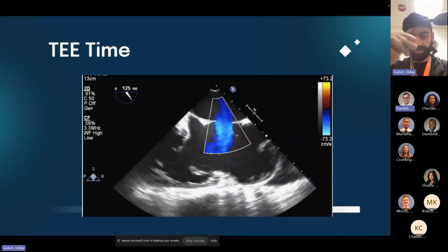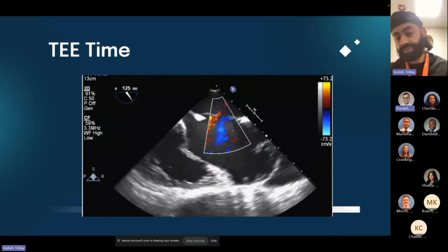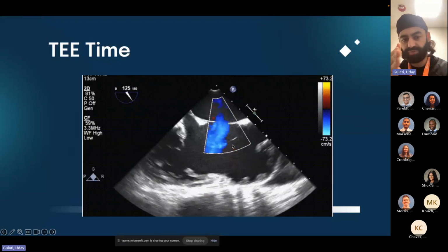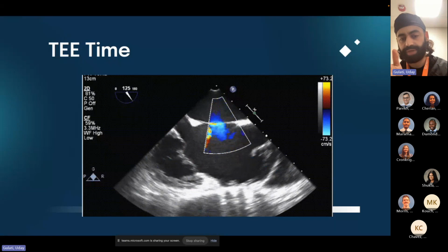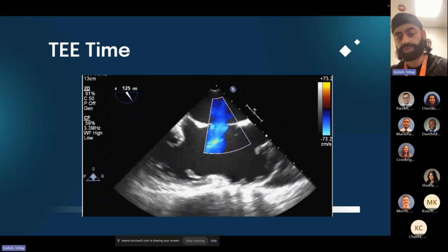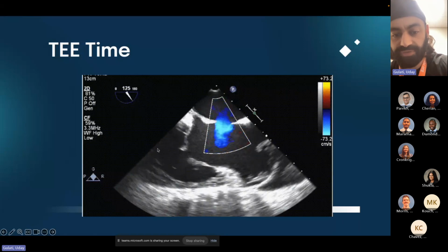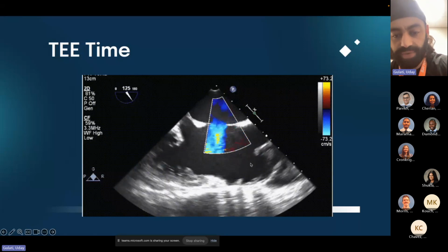Oh, so the right ventricle, and that's into the pulmonary artery. So I'm keeping it around 90 degrees. I've adjusted this slightly, which you'll do in a lot of patients, past 90 degrees. And what you're looking at is the bicaval view. So this is your superior vena cava. This is your inferior vena cava. This is your right atrium.